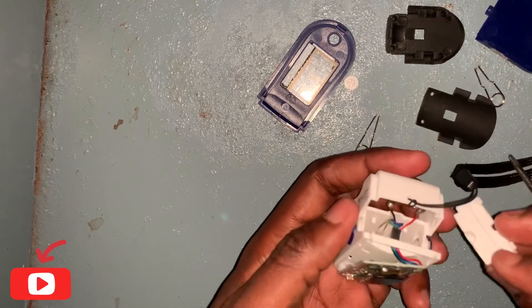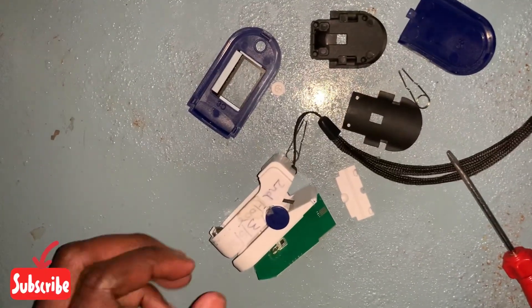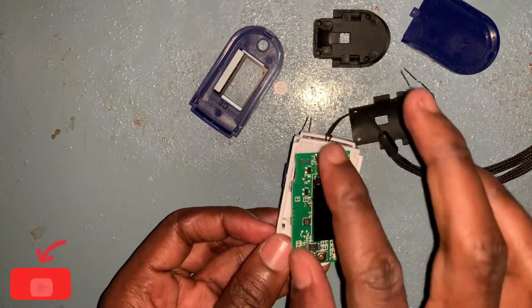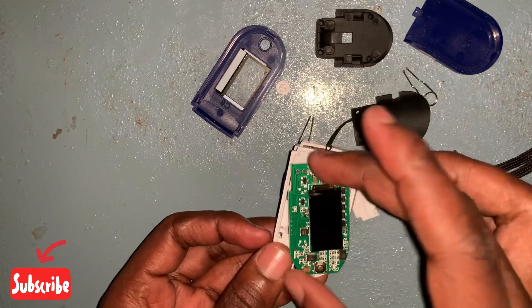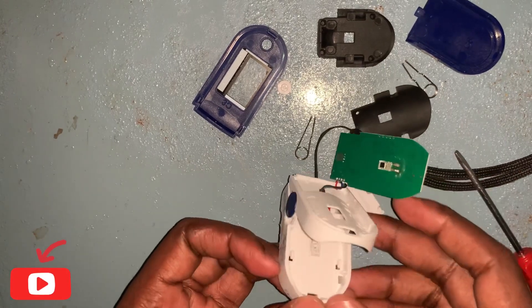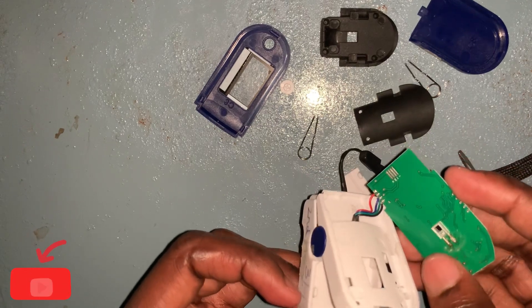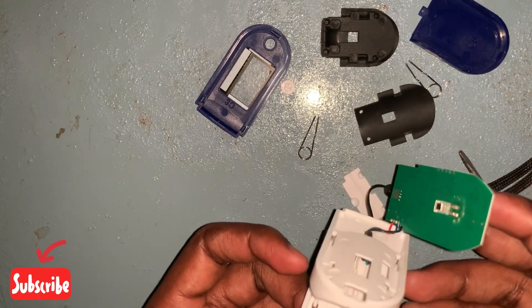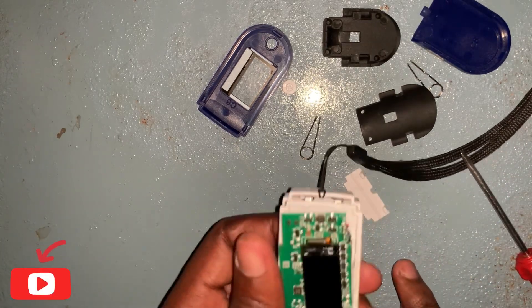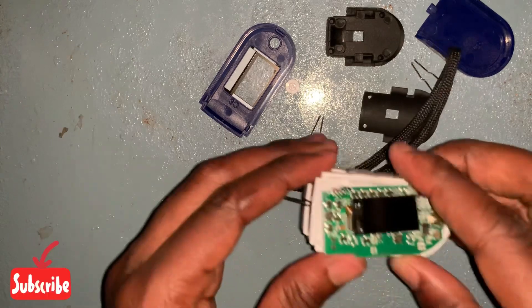We have completely dismantled this device. As you can see, this is the LED screen, this is the switch button, and this is the circuit board which contains all the components. This is the LED light, and this is the sensor that captures the scattered light and sends it to the circuit board where it gets processed and then displayed on the monitor.